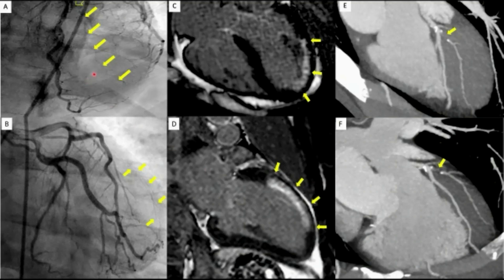This particular patient presented with typical signs and all the evidence for acute myocardial infarction. Was sent to cardiac catheterization, and the result was angiogram is normal. 2 or 3 days later, his attending physician requests an MRI with a viability study, and that shows very nicely an anterior nearly transmural scar. And then the patient is sent to coronary CT angio, which shows clearly the culprit vessel that was occluded. And if you go back to the angiogram, you kind of see it faintly opacified here, but it was missed during the angiogram.